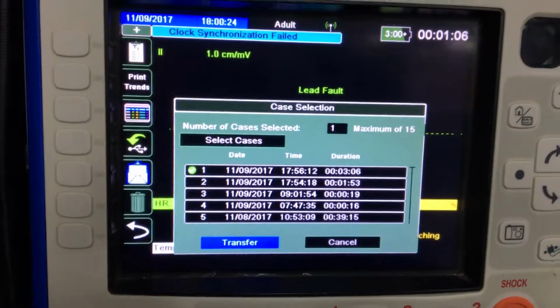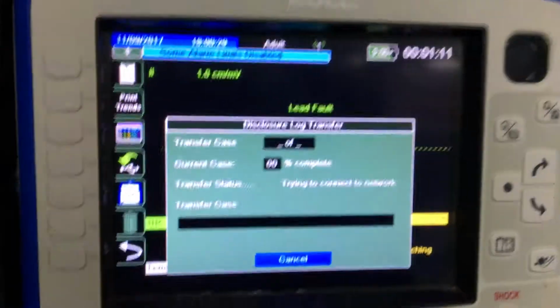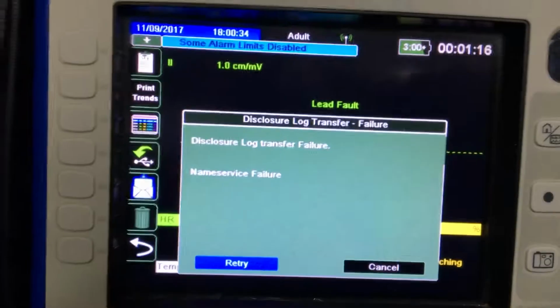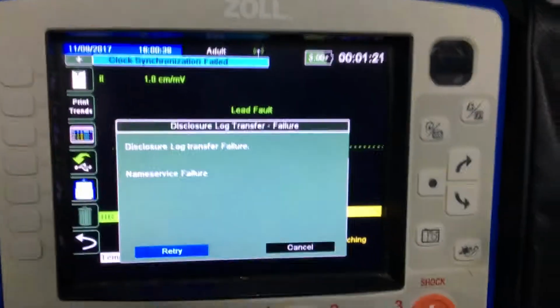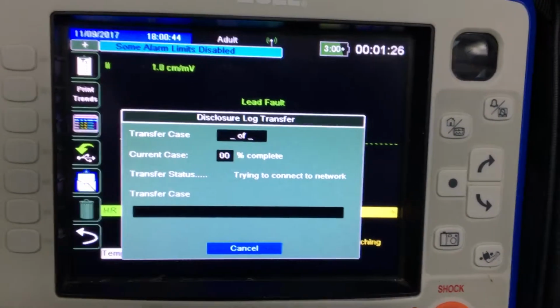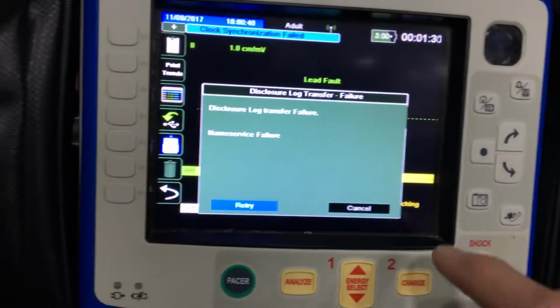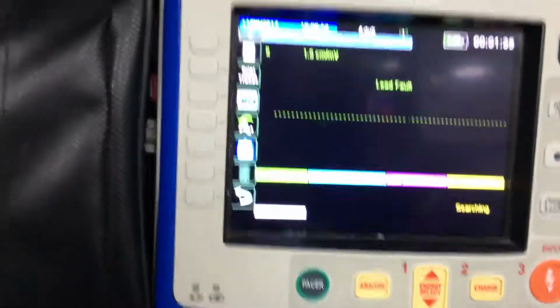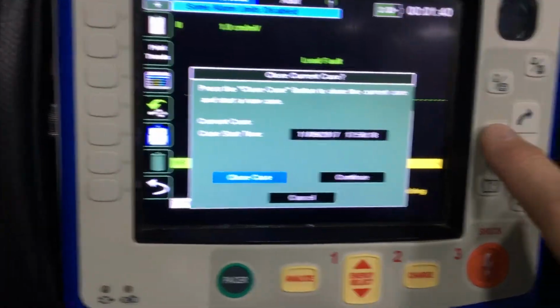Automatically sends it to the transfer button, and then you hit this button again. We'll hit retry. There may not have been enough stuff to, there's actually nothing. I'll just go to cancel for now. Try it one more time. Close case.